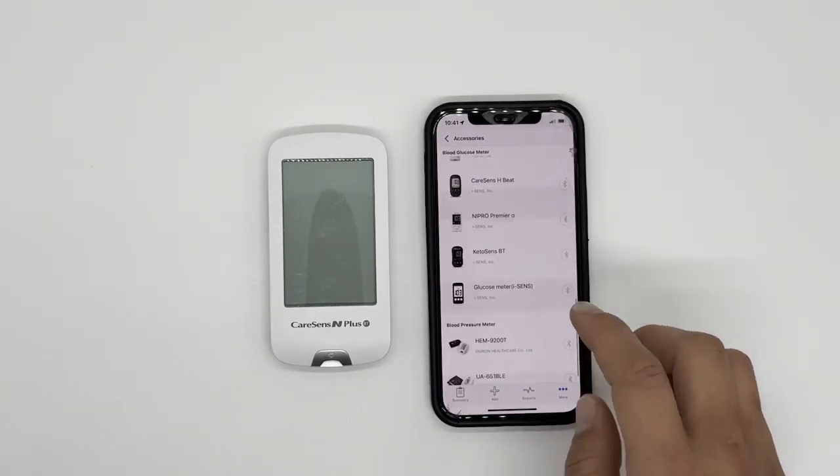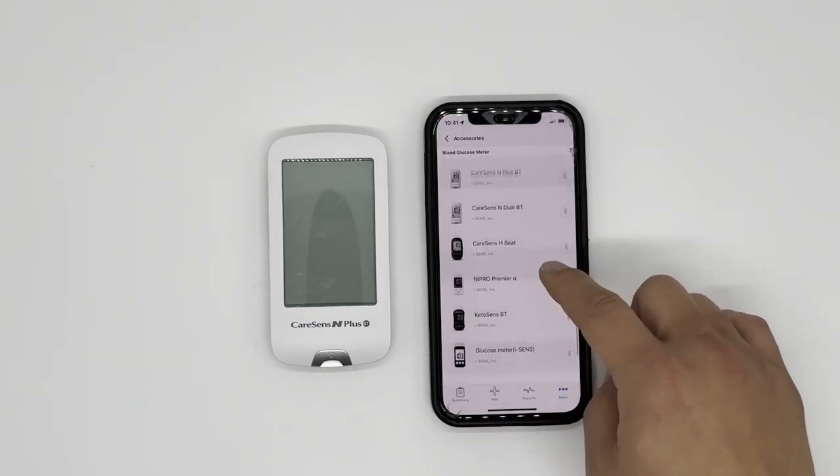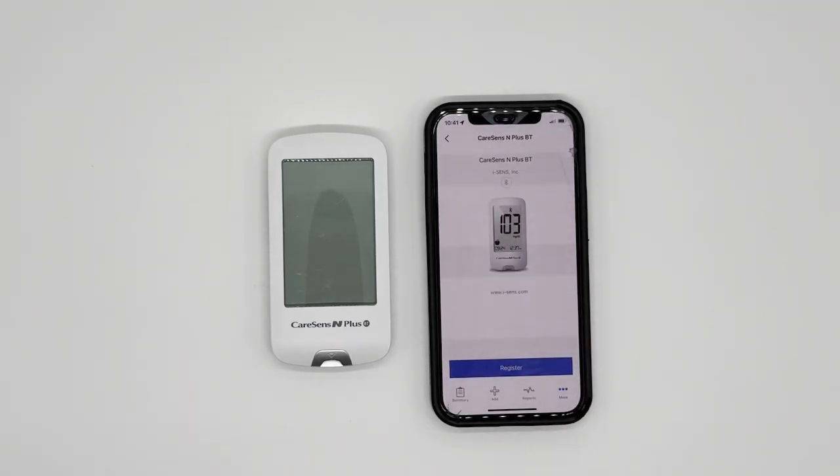Or you can also choose Glucose Meter (iSense). I'm going to use CareSense N Plus BT. Make sure you have the Bluetooth function on on your phone, then tap Register.